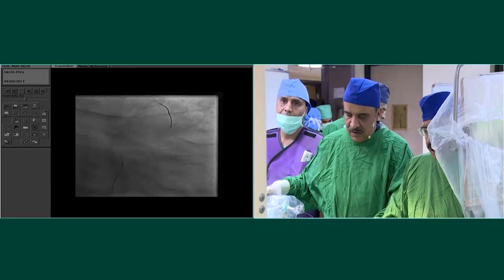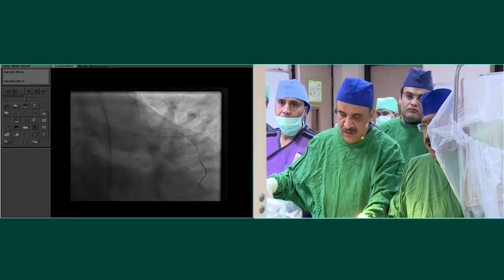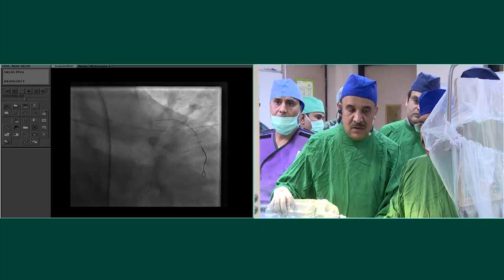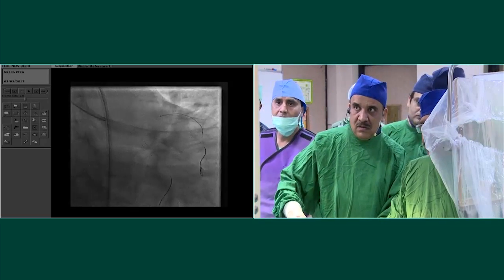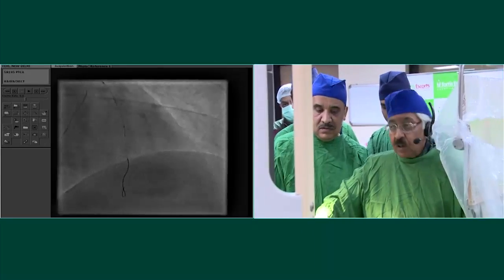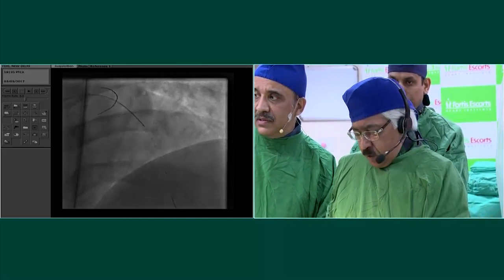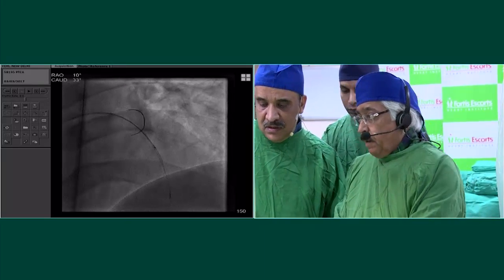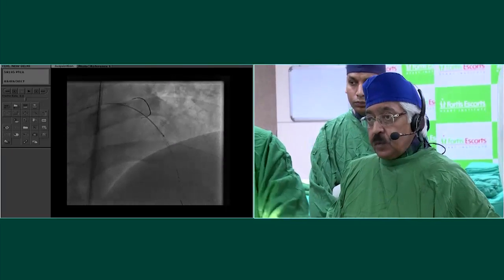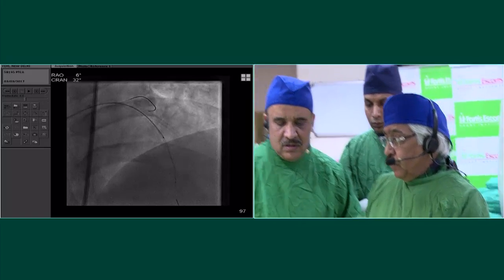Covering the circumflex is not a big deal. By the way, I was able to pass even a balloon through that. Okay, here we go. Go cranial. Okay, and let's take an OCT. Maybe you can see the OCT live already, so that you can have the first idea. Okay, ready?